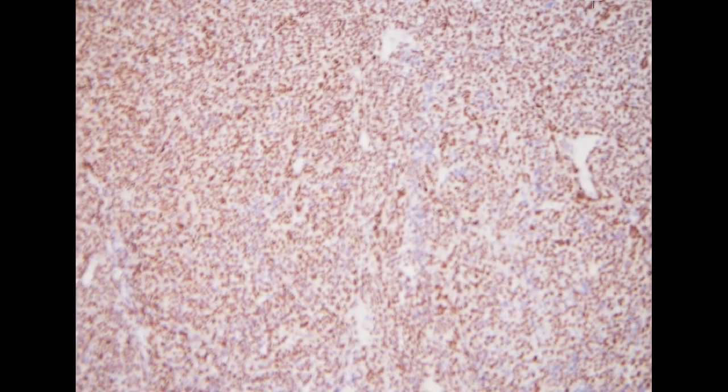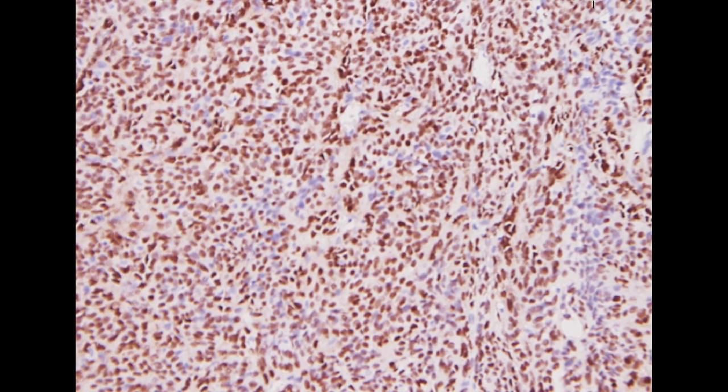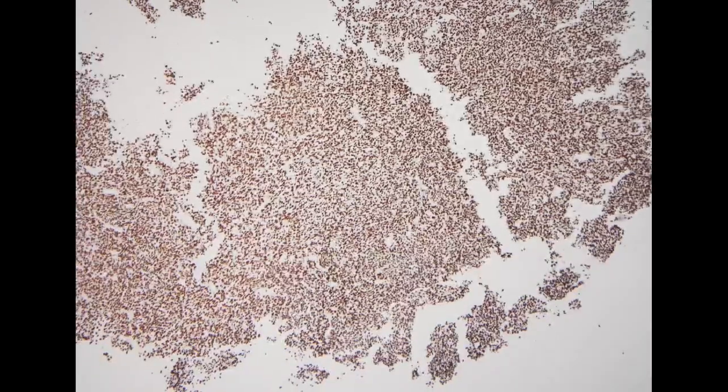So nowadays we have a very specific and sensitive immunohistochemical marker which detects the exact fusion site of the protein, SS18-SSX. So the antibody just catches the peptide around the fusion site, and it can show this diffusely positive nuclear pattern. So with this antibody, the case is confirmed to be a synovial sarcoma. We also have some more traditional, more non-specific markers, such as TLE1, which can also be diffusely positive in the nucleus.